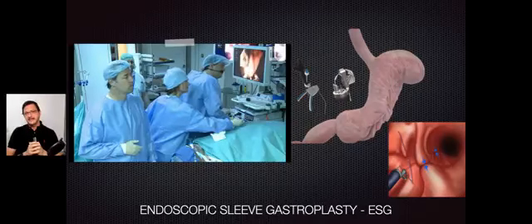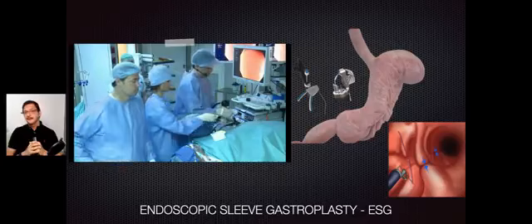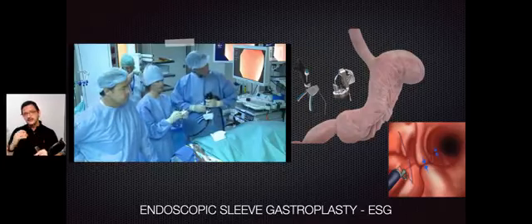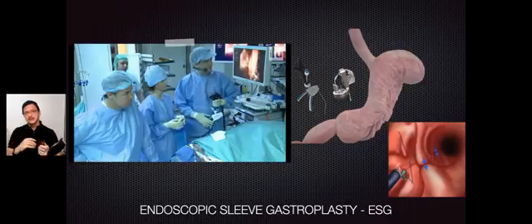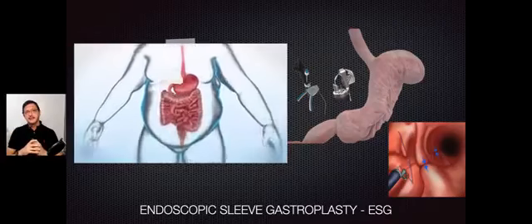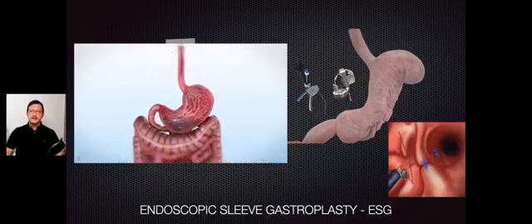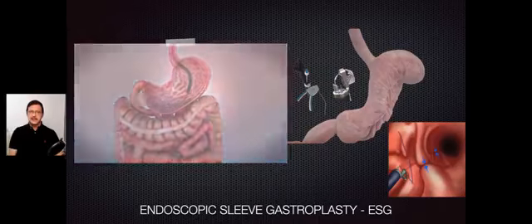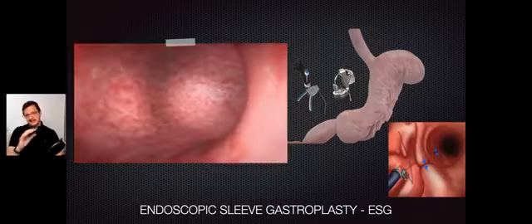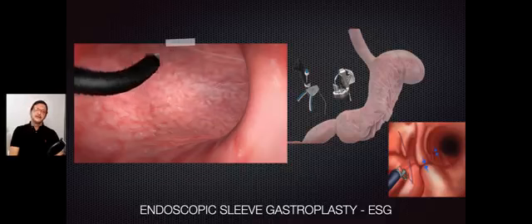We have a surgical grade needle with Prolene 2-0. Then we close, we exchange the needle, and we pass the needle from one side to the other, as you can see globally here. But we can show you better in this animation as we go to the stomach. Our aim is to work on the greater curvature as in the laparoscopic plication. So, as in the laparoscopic plication, we start at the incisura, and eventually you can mark the anterior wall and the posterior wall.